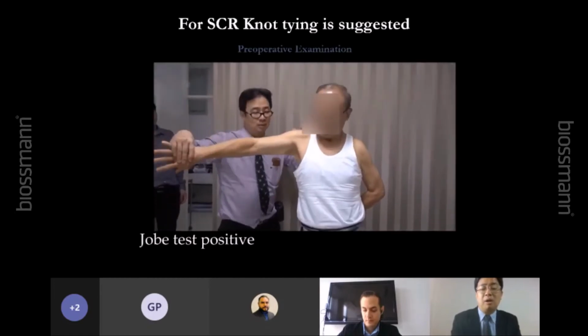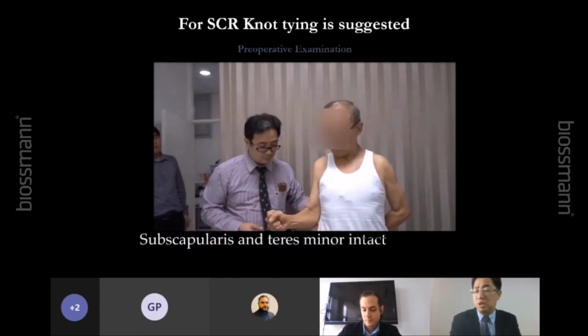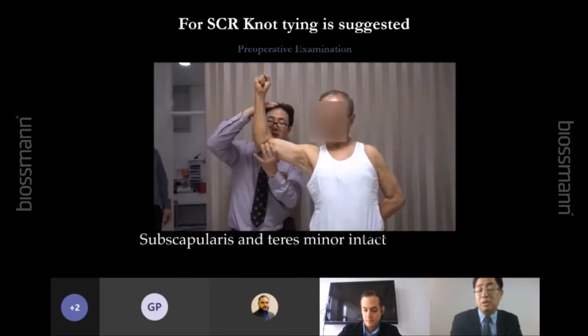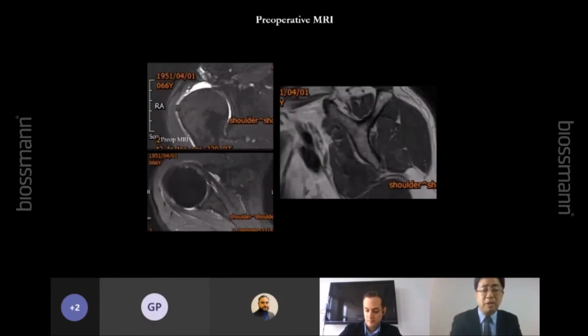So for the knot tying, we still use knot tying for the superior capsular reconstruction, the SCR, because the tissue is quite thick. If you do the knotless, I think it's not good. The patient may have a re-tear. So we tried knotless for the SCR, and it failed because the cuff is very thick.